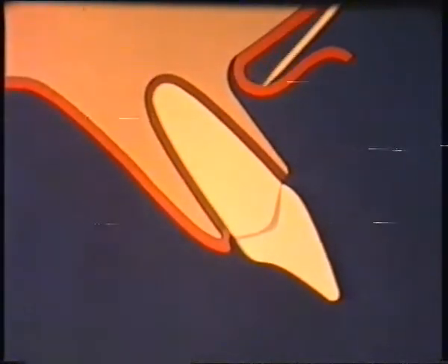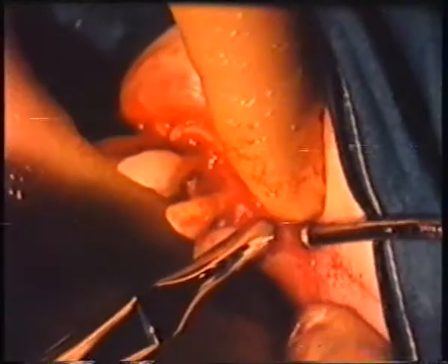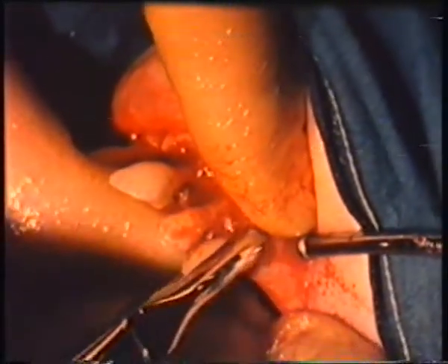Next, the mucoperiosteal flap within the area outlined by the incision is reflected upwards, exposing the underlying bone of the outer alveolar plate. A periosteal elevator is being used for this purpose. When this part of the operation has been completed, the upper anterior teeth are removed carefully with forceps.